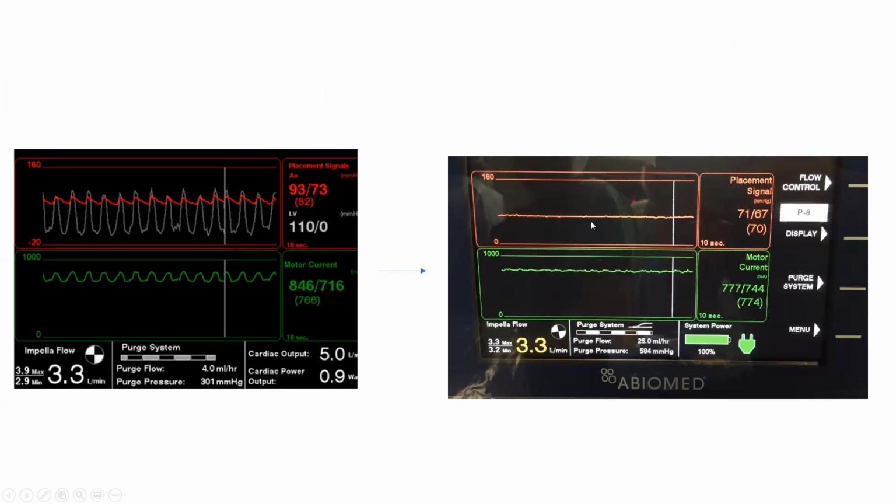When you lose aortic pulsatility on the Impella console and on the motor current, this means that you are now fully dependent on the continuous Impella flow with very little intrinsic cardiac output, which means retrospectively that if you did not have the Impella, that patient's blood pressure would have severely declined, and this may have initiated a full-blown circle of more hypotension and more hemodynamic compromise. So having, in retrospect, a prolonged period of flattening of your Impella curves tells you, well, Impella helped me in that case.